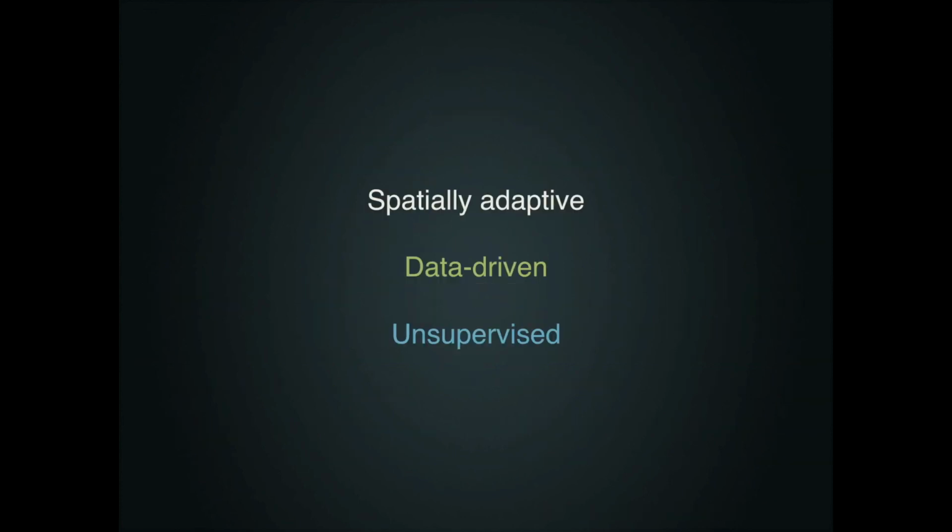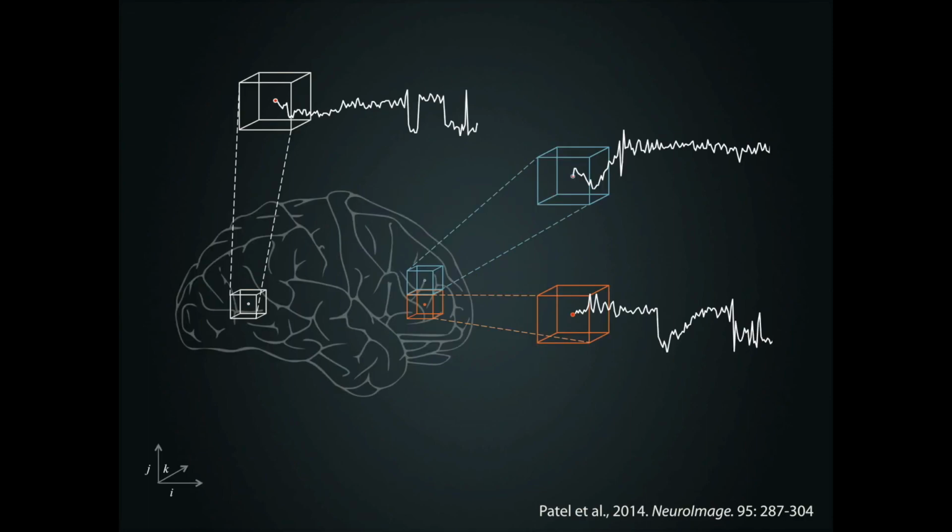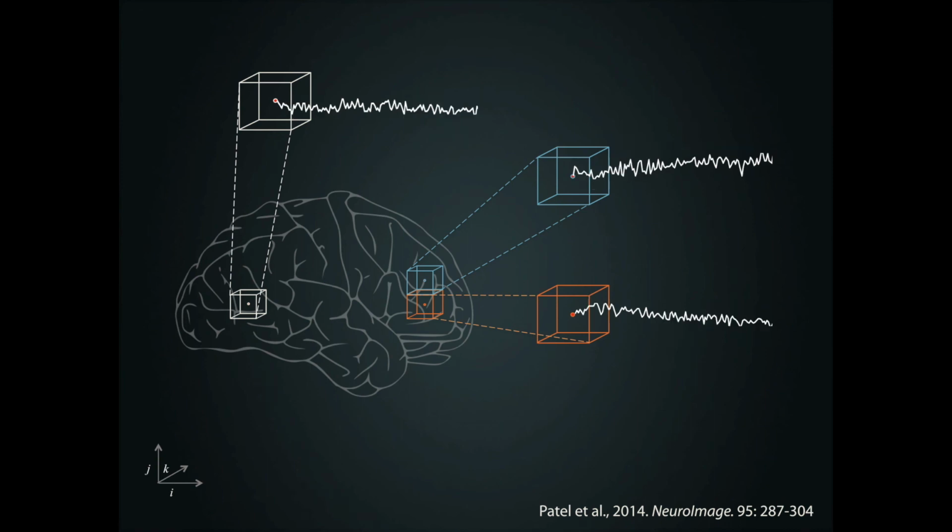So, to summarise, the algorithm is spatially adaptive, i.e. only despikes artifacts in parts of the brain where they occur, and thus avoids the overfitting problem. It's data-driven and model-free, which is a good thing, because as I described earlier, it is very difficult to model motion artifacts, and it performs excellently when left unsupervised. So now if we go back to our original example containing locally similar motion artifacts, and we successfully denoise the artifacts, we can get rid of the connectivity bias.